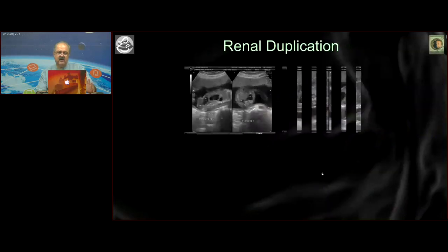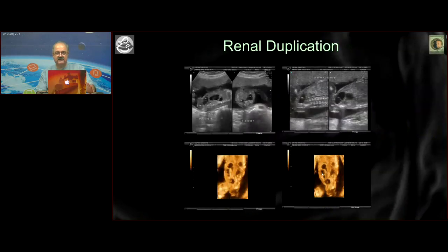When it comes to looking at cystic spaces that you're not sure of, like in this particular one, cystic spaces in the renal fossa, cystic spaces below the renal fossa, cystic space in the bladder, and within the bladder another cystic space, it might become a little difficult to sort out. The best thing in that situation is to run a 3D acquisition in one of those long coronal planes in the posterior part of the fetus, and everything stands out instantly because we have inherent contrast without using radiological contrast in the fetus. And this is how it works.